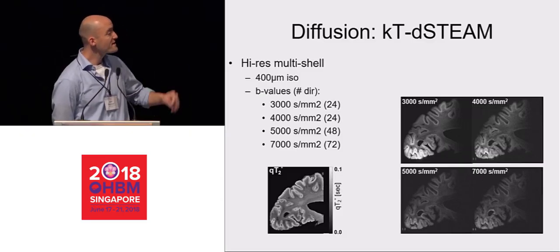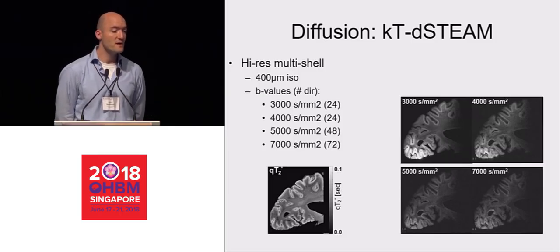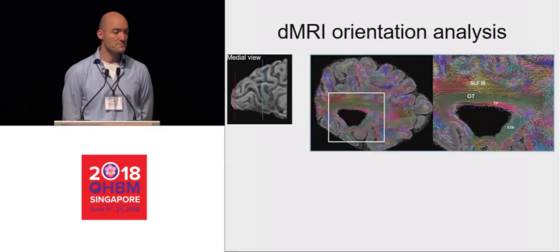You can see the raw data on the right there, and you can see that we have quite exquisite contrast between white and gray matter, and also quite exquisite spatial resolution in these scans.